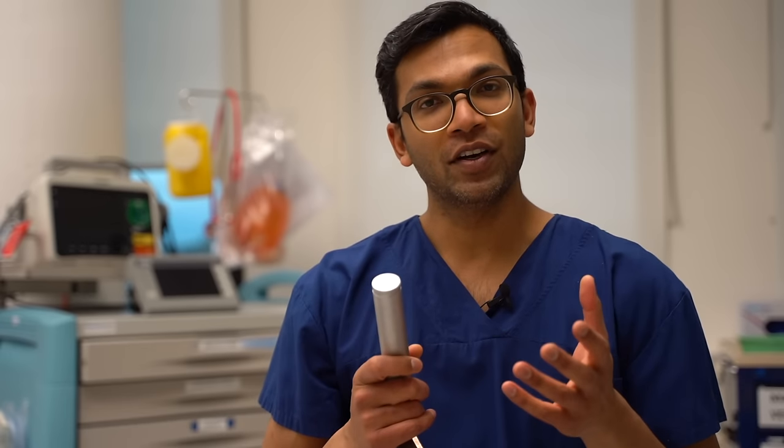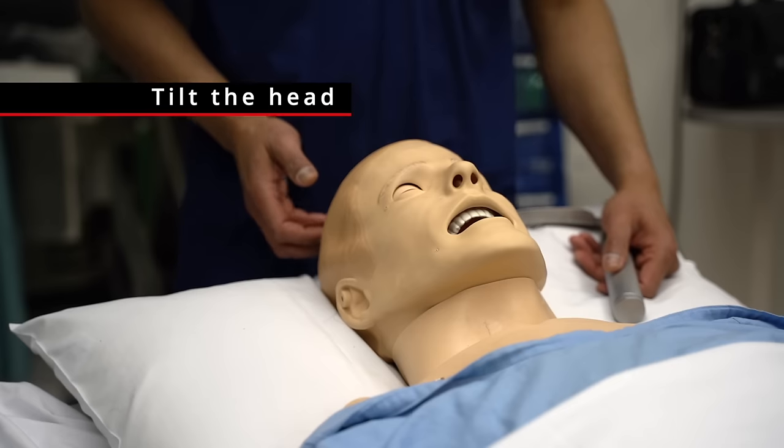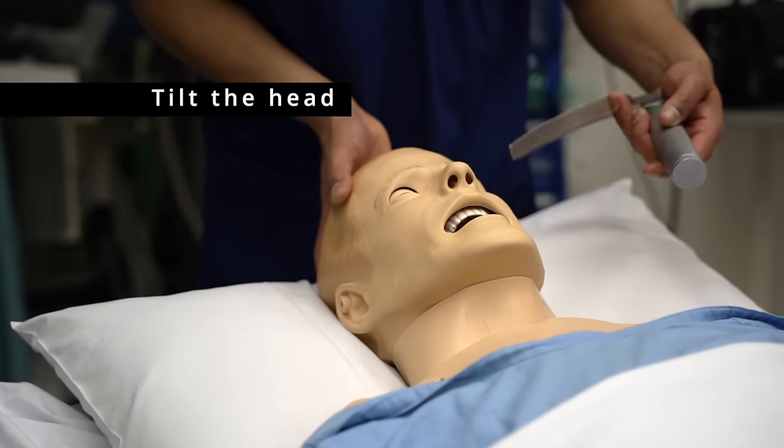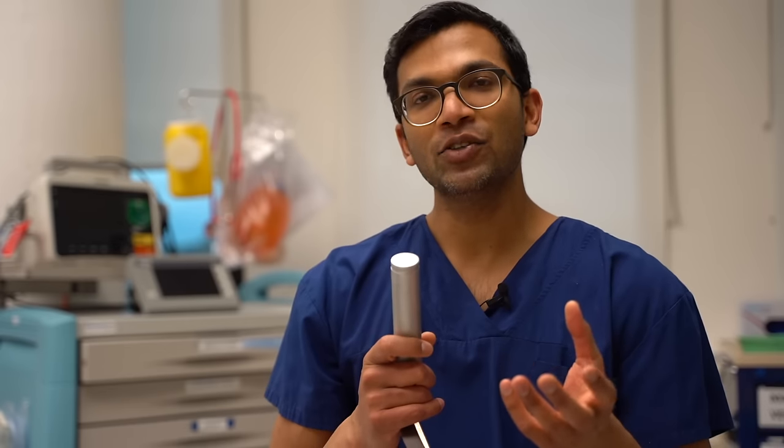When I'm intubating, the very first thing I do after the patient is sedated and paralyzed is I tilt the head back. What that does is tilt the head on the atlantooccipital joint, which opens the mouth slightly and also gives me a better aperture down into the trachea.